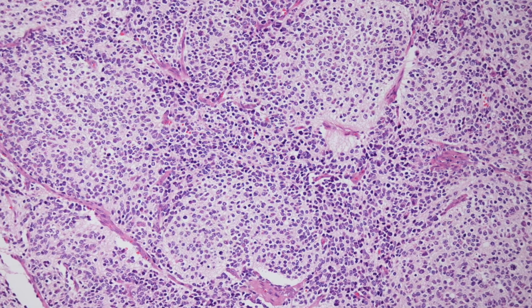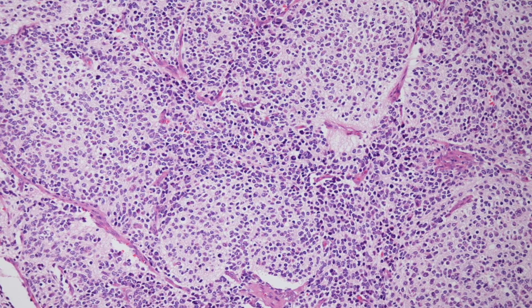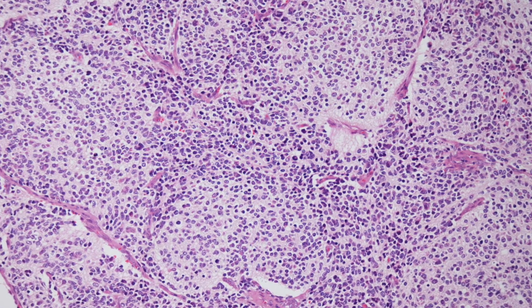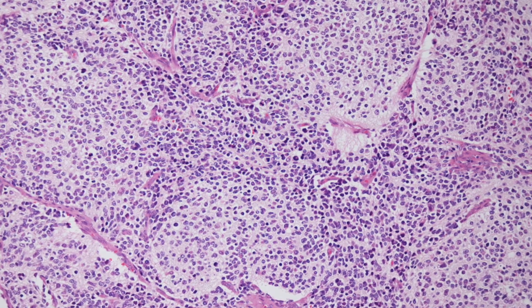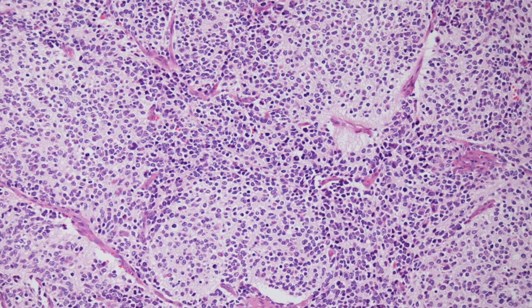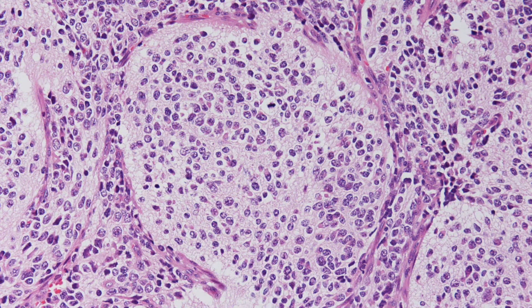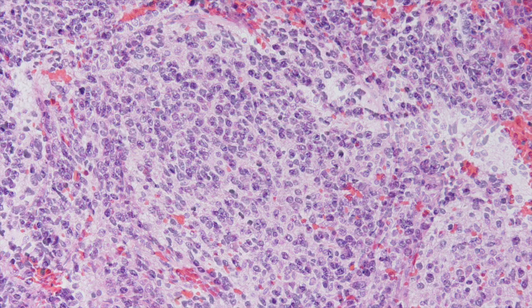A higher magnification, another higher magnification, and an even higher magnification here. And this is another field from the tumour.